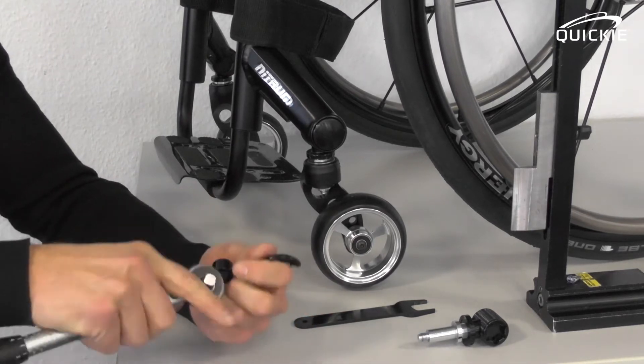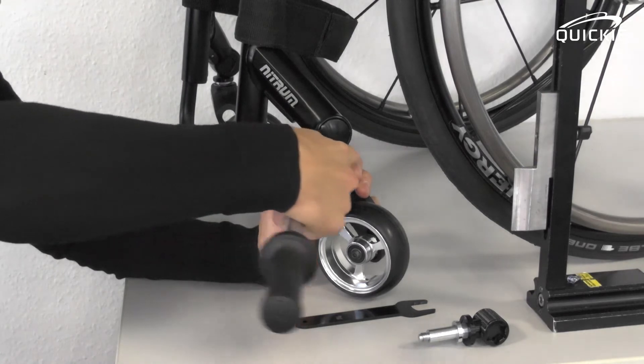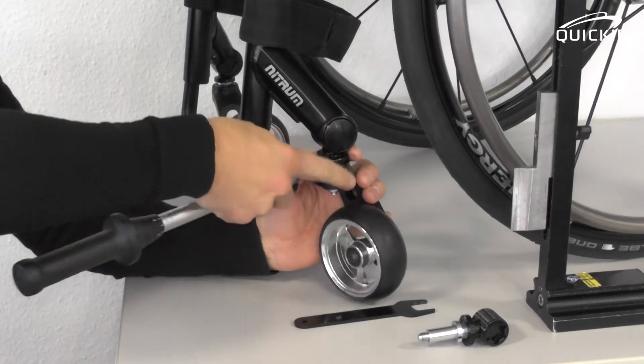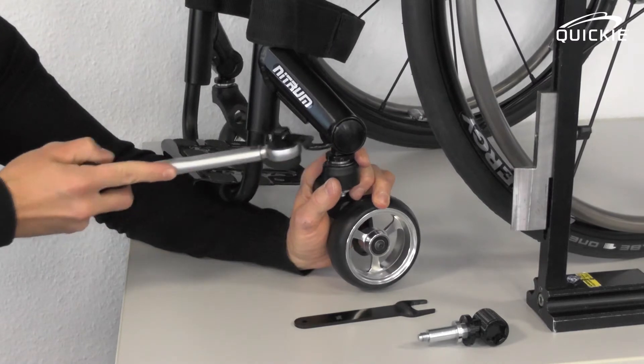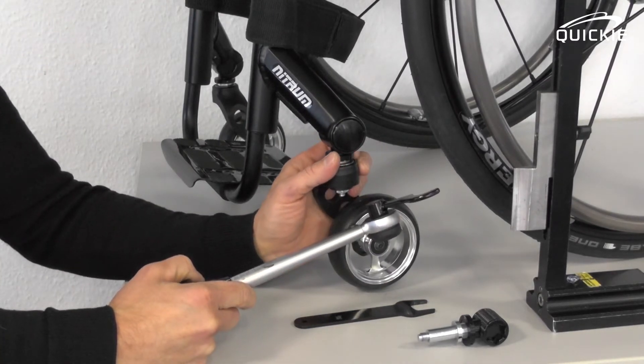Take the special tool, clip it on a wrench, and open the round nut. It can be pretty tight, so you might need some force for that.